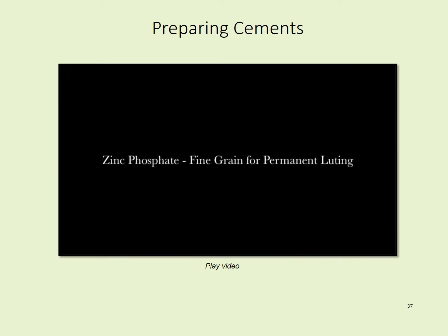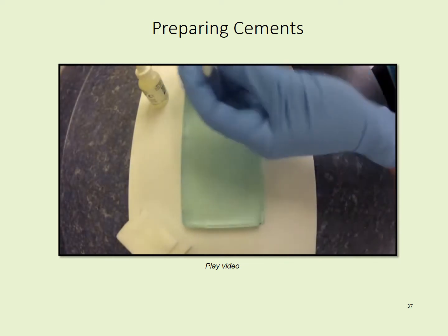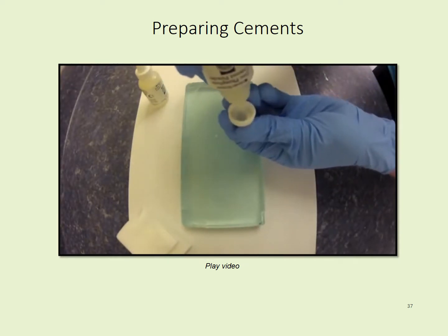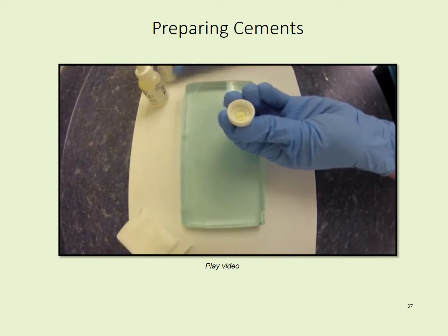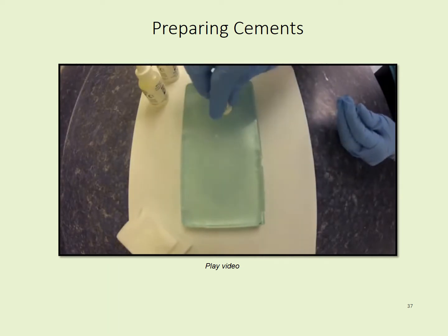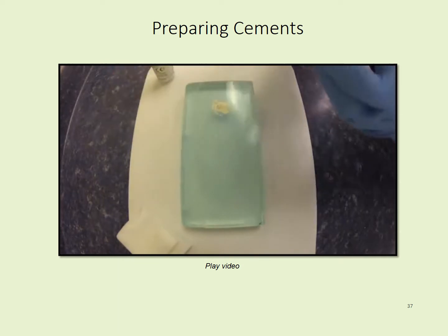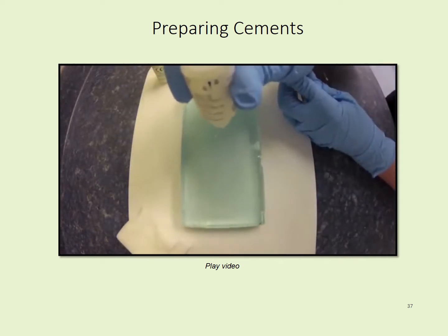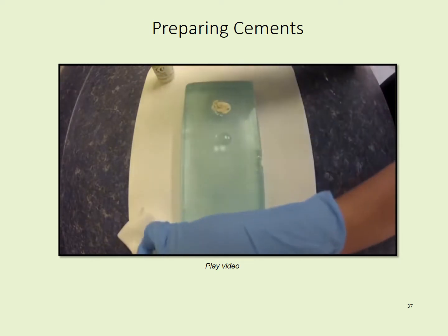As a permanent luting cement. The thing with zinc phosphate that we have to remember is that it is exothermic, which means that it does release heat. So we want to mix it on a cool glass slab to absorb some of the heat produced. To dispense the powder, fill the cap to the shoulder and dispense onto the glass slab. For the liquid, we want to dispense 6 even drops. If we need more material, we can always double this ratio.